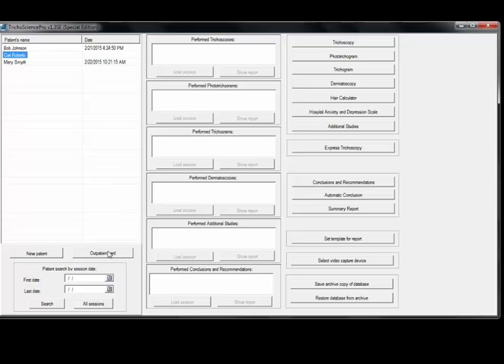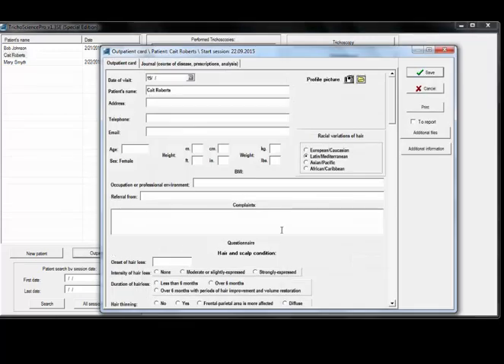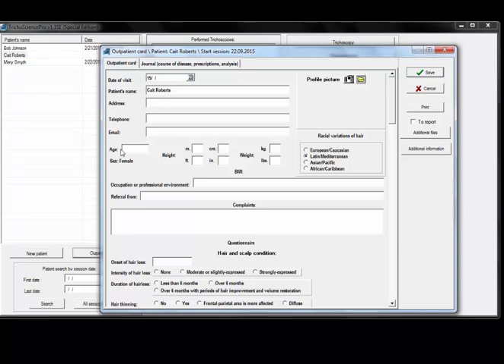Then you can click on outpatient card and this is where you enter more information such as their contact information and their age, height, and weight. This information right here is critical for the analysis, so you want to make sure to fill that in because it gets saved into the software and is used for reporting later on.